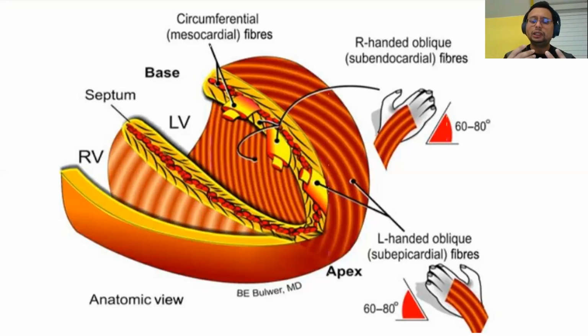Okay. And of course, the left atrium and right atrium also have their own strain values. So for the left atrium, the normal strain value should be about 42% and above. However, we take 26% as the threshold of abnormalities for the left atrium. For the right atrium, it's about 22% as the threshold of abnormalities. Okay, so these are the normalized strain values. The reason I tell you this is that I only recently got to know these normative values for all the chamber cavities, and I wanted to share them with you here.